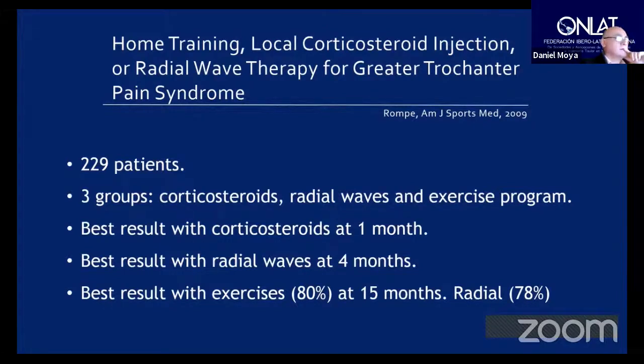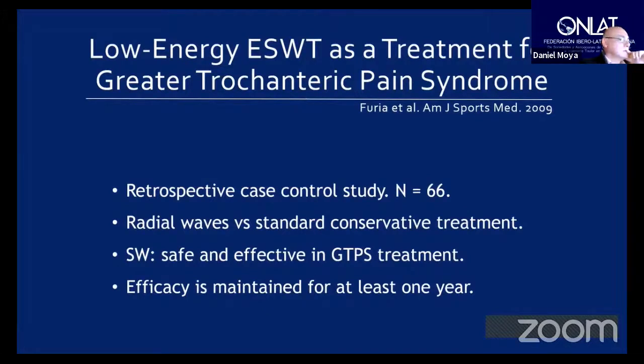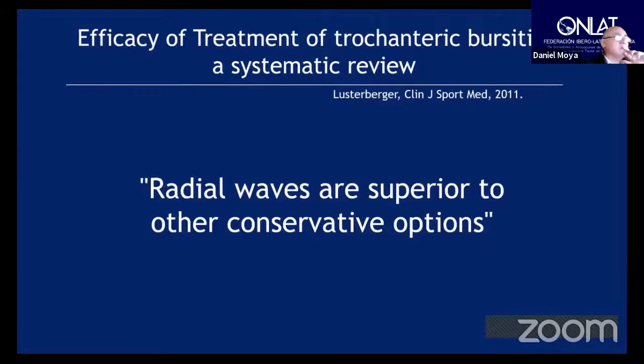So they are comparable. Another good paper by John Furia included 66 patients in a retrospective evaluation, and they compared radial waves versus standard conservative treatment. Their conclusion was that radial waves were safe and effective in the treatment of greater trochanter pain syndrome, and that the efficacy is maintained for at least 1 year. Lustenberger, in a systematic review, stated that radial waves are superior to other conservative options. As you can see, most of the papers are related to radial waves, but in our case, we have been treating patients with focus waves for many years, 20 years.